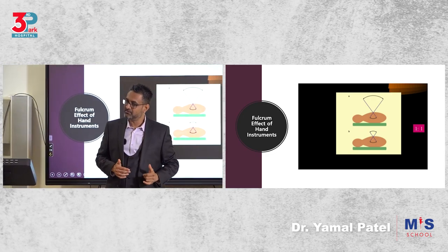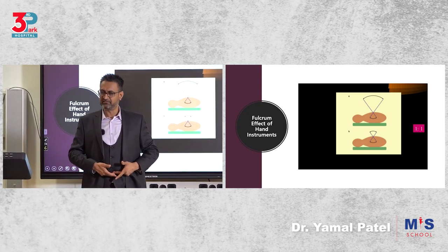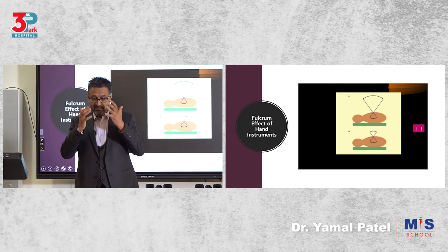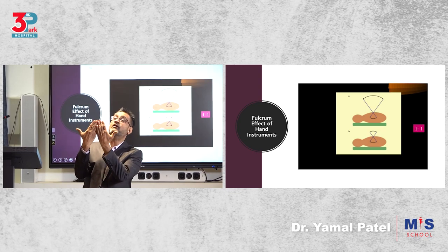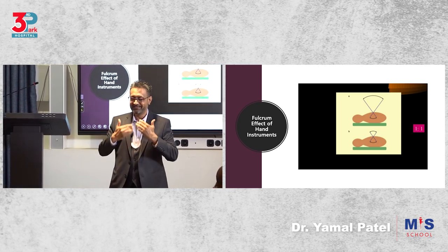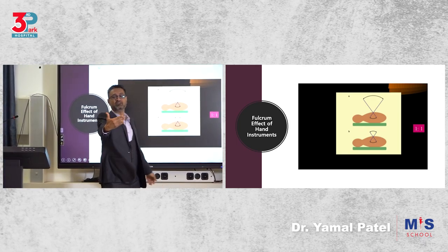So try and maintain a 1:1 ratio, so your positioning of the port could actually change based on the size of the pathology. Okay? If the uterus is up to the umbilicus or just below the umbilicus, you can't put a port in the umbilicus now. You'll be sitting and watching the uterus like this, and you'll be wondering, how am I supposed to navigate this? So what do you do?